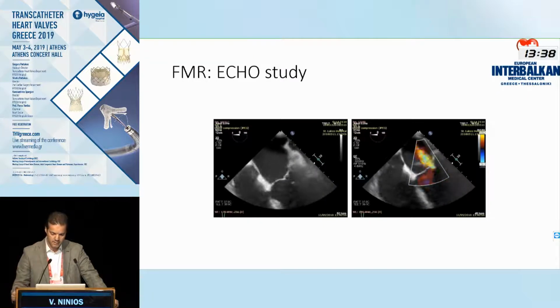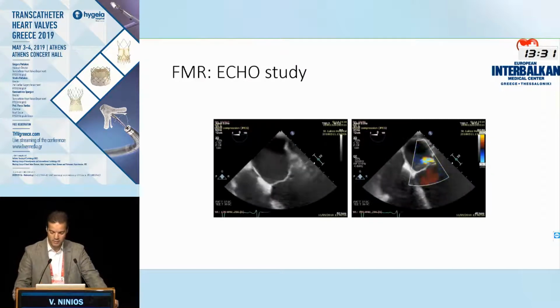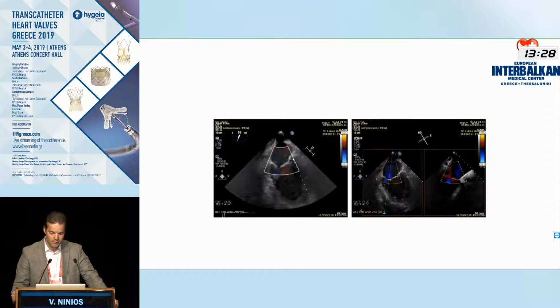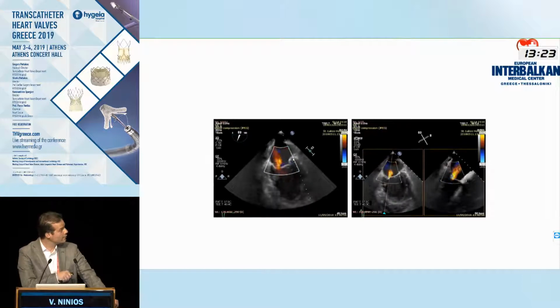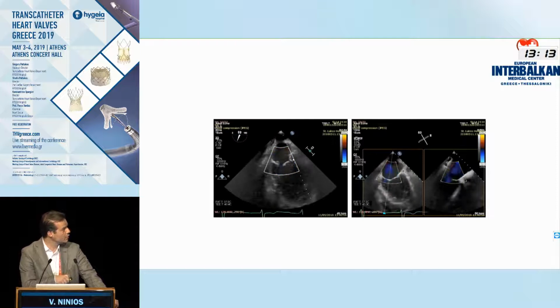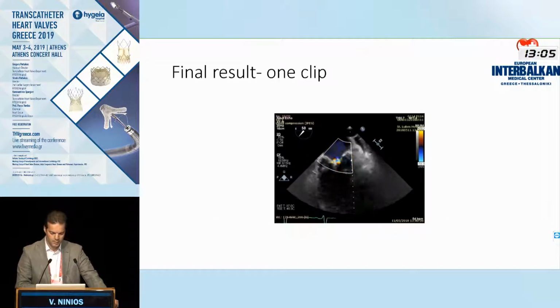Now this is a case, here is a functional mitral regurgitation. You can see that the leaflets are being tethered and pulled inside the ventricle, and there's a central jet of significant mitral regurgitation. Now we go to the commissural view. Clearly we can see that there is a jet, which is mainly in the medial part of the valve. Here is the lateral commissure, is spared. The medial part is more pulled because this patient has got an inferior myocardial infarction, and this is very clearly seen on the X-plane. So one can think that if I put a mitral clip there, which we did, straight in the middle of the jet, we can do the job.